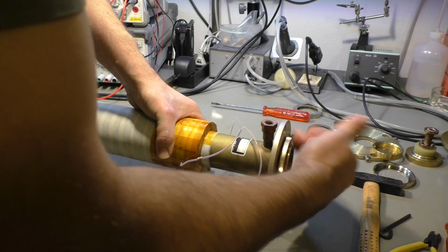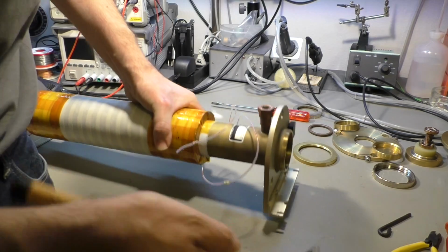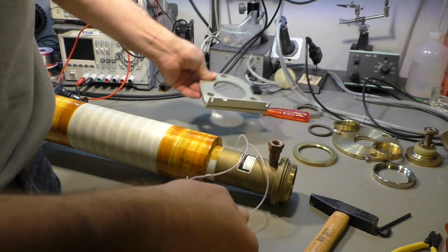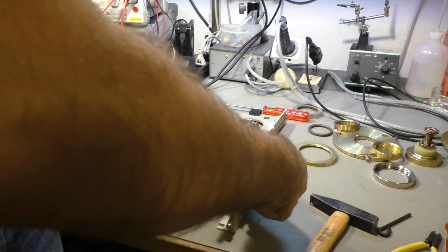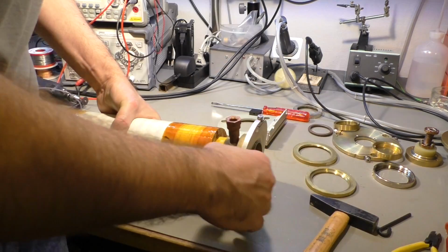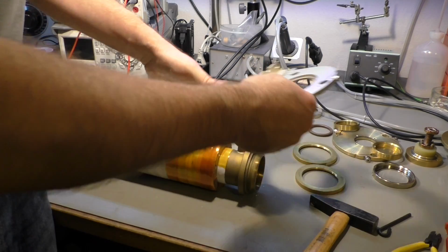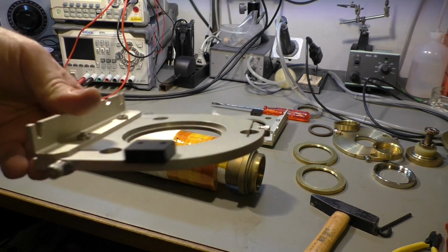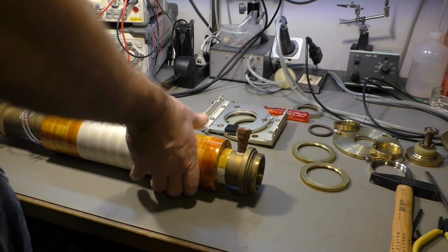Okay, I loosened that nut here with another brutal method. I just tapped here to make this part turn, and then it was loosening the nut too, and the other one was already loose for some reason. Massive brass rings. Aluminium. Nice for reattaching the three rods. Maybe I can use that for something. Making a tripod of some sort.